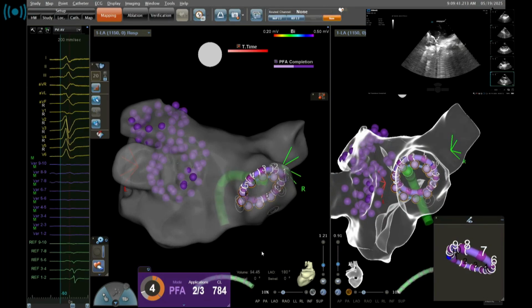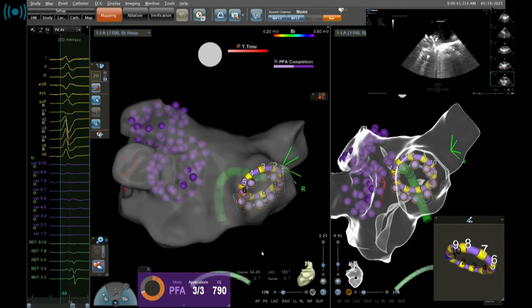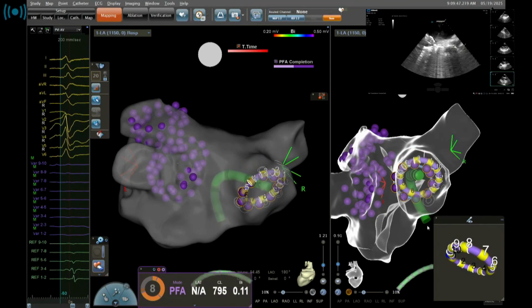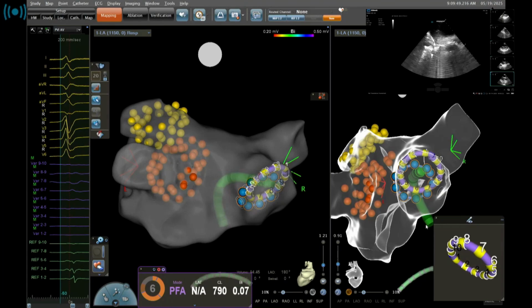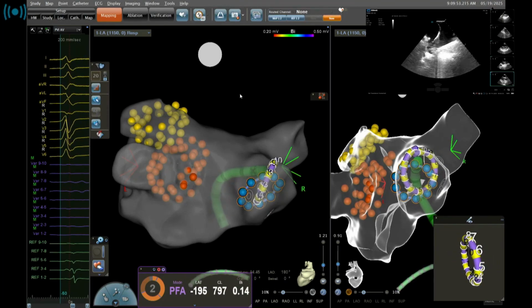You see which one is touching, so you switch them off. It's not automatic. Is there feedback from the ablator with impedance? No, it's only visual. You see which one is touching.